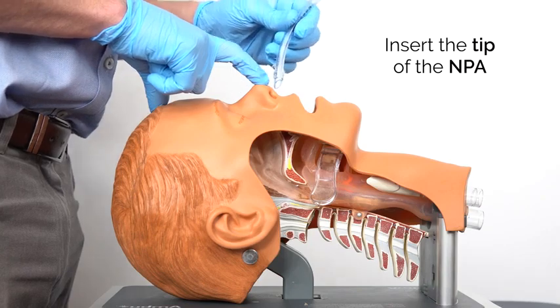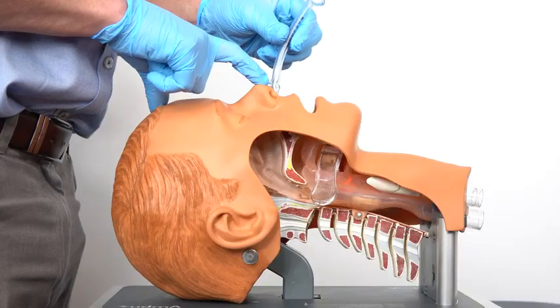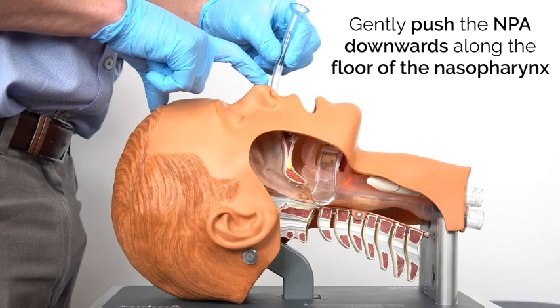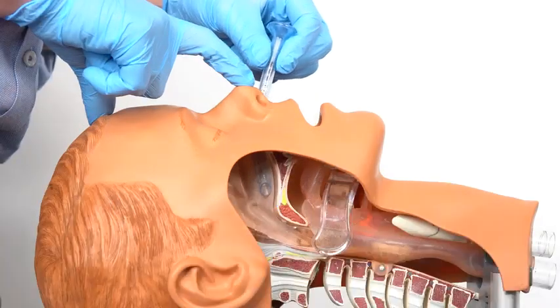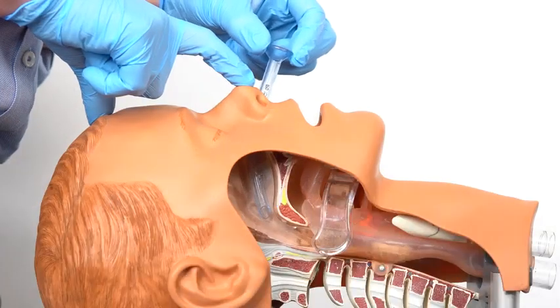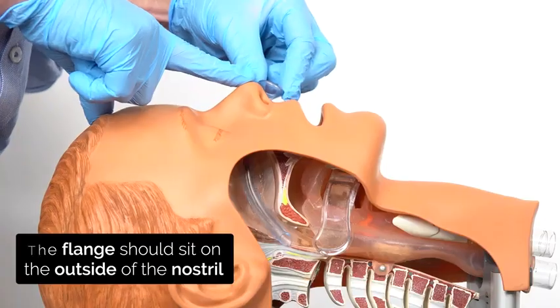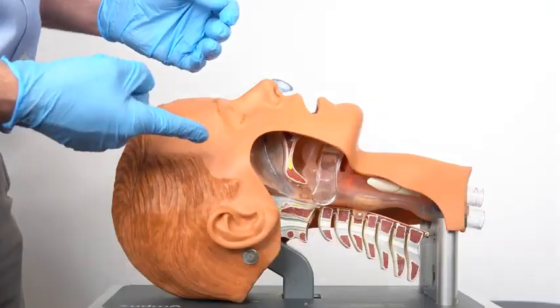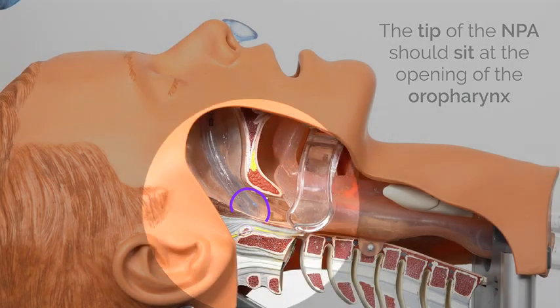Then we're going to gently insert the tip into the nostril, and I'm heading downwards, gently twizzling the tube, letting it gently seat itself in. I'm going to keep pushing, gently twizzling until the flange sits comfortably on the outside of the nostril. You can see in the side cut where the tip of the tube is. So if the tube was too long, potentially the patient may start gagging or coughing, in which case you'd remove the tube and replace it for a smaller size.